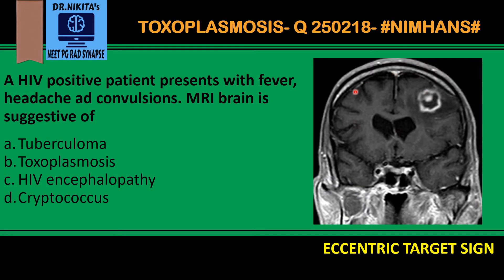This is a contrast enhanced MRI of the brain in an HIV positive patient presenting with fever and convulsions. On the contrast enhanced MRI, we see a lesion where white indicates enhancement. There is peripheral or ring enhancement, plus an additional enhancement located eccentrically within this lesion.